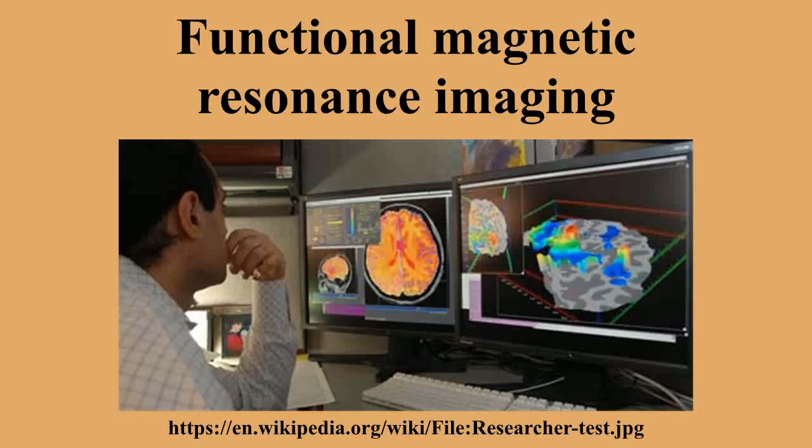A higher amplitude signal may be seen for stronger neural activity, but peaking at the same place as a weaker signal. Also, the amplitude does not necessarily reflect behavioral performance. A complex cognitive task may initially trigger high-amplitude signals associated with good performance, but as the subject gets better at it, the amplitude may decrease with performance staying the same.